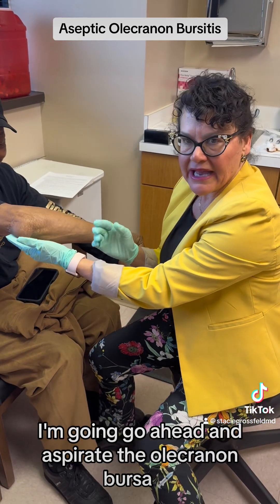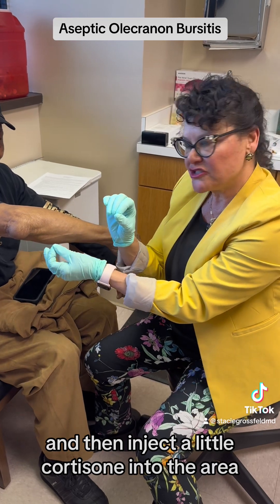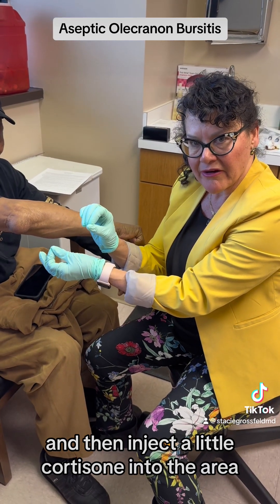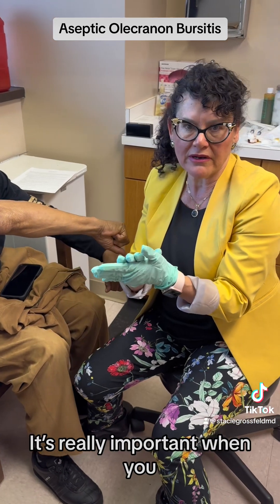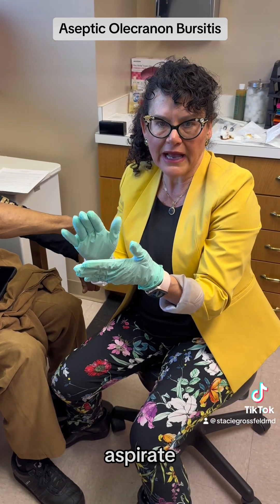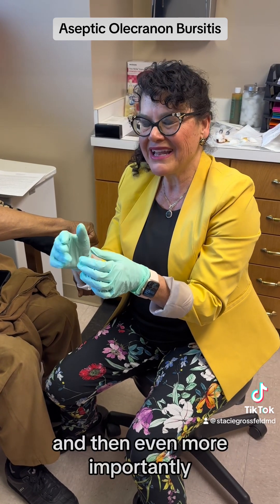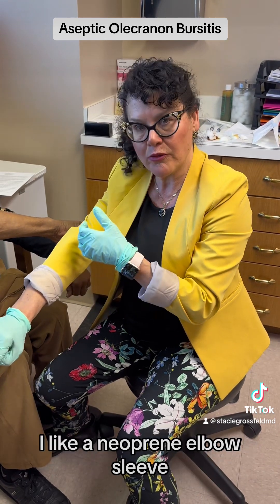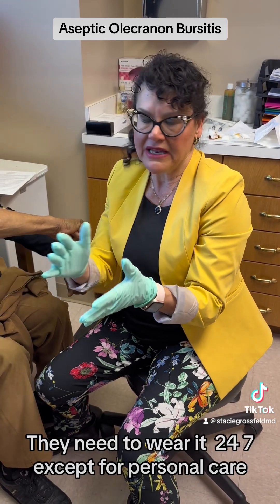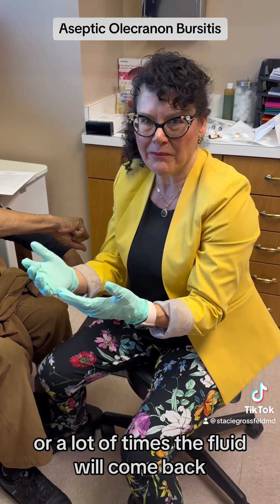I'm going to go ahead and aspirate the olecranon bursa, then inject a little cortisone into the area, and then put a compression dressing on it. It's really important after you aspirate that you inject at least 40 milligrams of Kenalog. And then even more important, you need to put a compression dressing on it for two weeks. I like a neoprene elbow sleeve — they need to wear it 24/7 except for personal care, or a lot of times the fluid will come back.